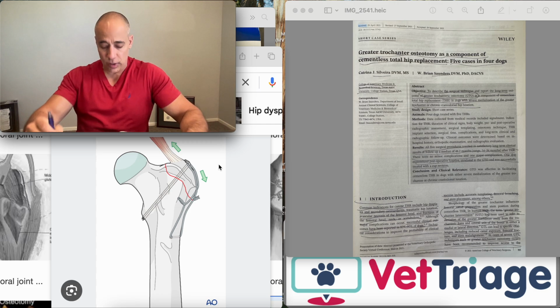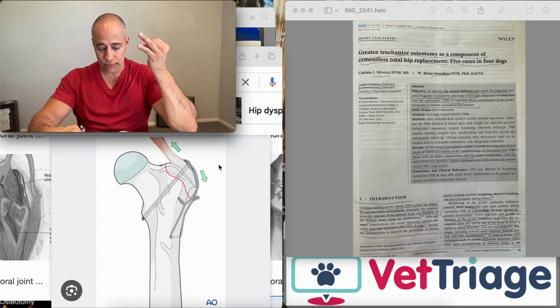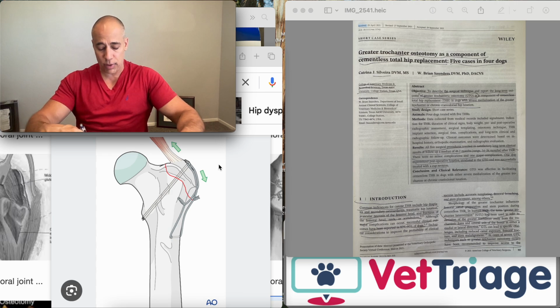Discussion. Reported advantages of the osteotomy in people include unimpeded access to the trochanteric fossa, improved ability to identify the central axis of the femur, and preservation of gluteal muscles during broaching. It also improves exposure of the caudal acetabulum for joint capsule dissection, eases acetabular bed preparation, and facilitates prosthesis reduction. This is of interest because a substantial number of dogs presenting for total hip replacement have luxoid phenotype of hip dysplasia and the chronic craniodorsal luxation.